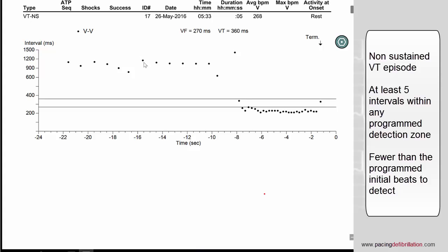You can see an example here with the normal rhythm, then the acceleration inside the VF zone and the spontaneous termination of the episode. There are 28 fast cycles.